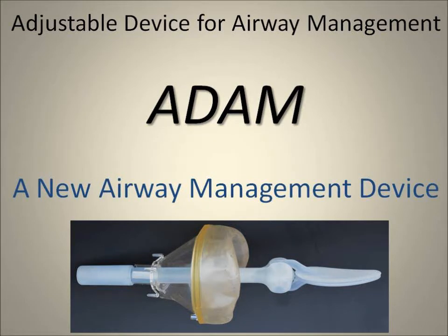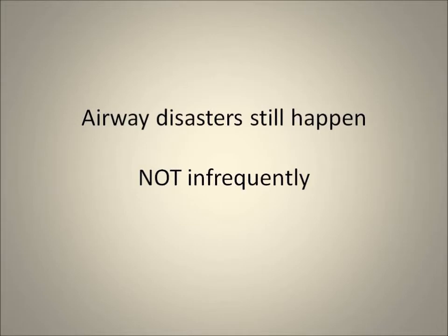Adjustable Device for Airway Management. ADAM, a new airway management device. Airway disasters still happen, not infrequently.